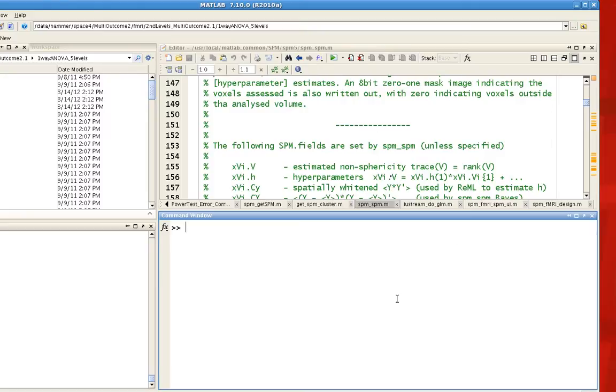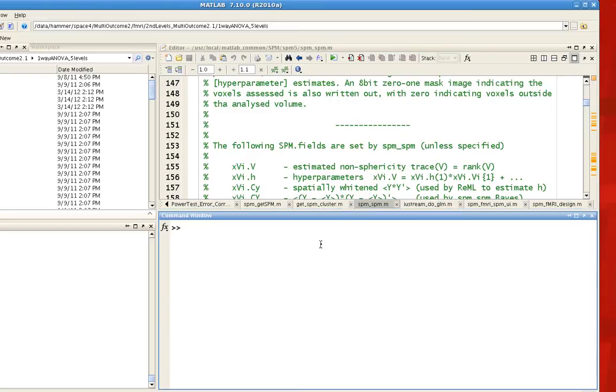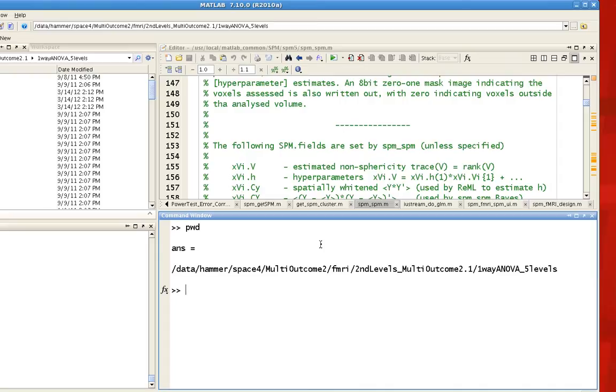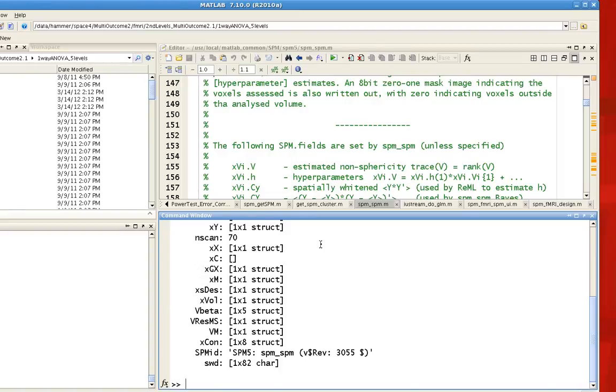One of the most important ones is something called SPM_SPM. So I'm in a directory which has already estimated a model, and if I load SPM into memory, just type load SPM, and then the SPM structure, you'll see all these different subfields like XY, XX, and so forth.